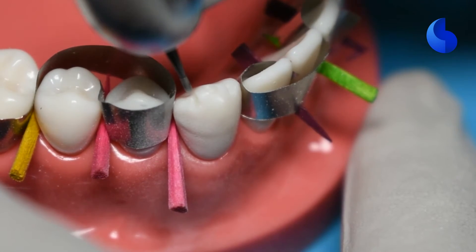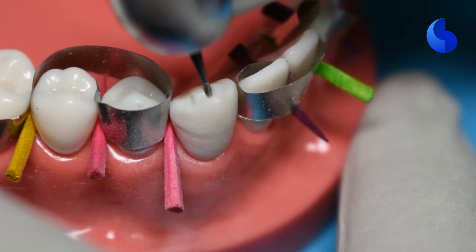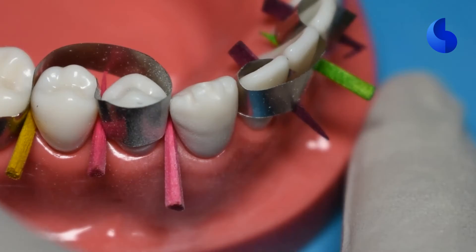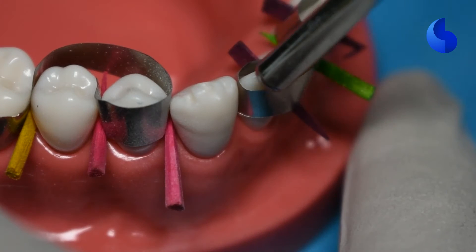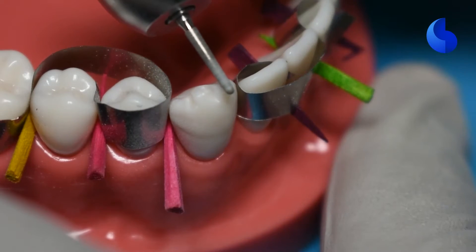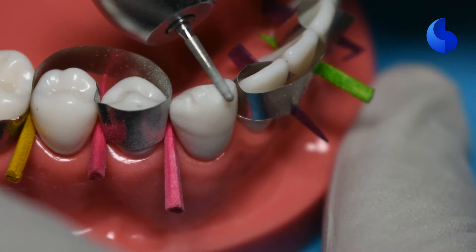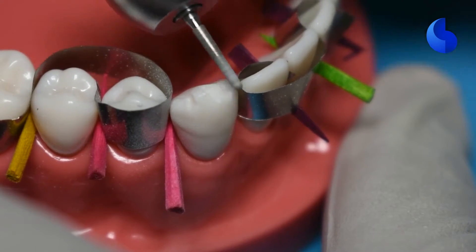You can also use a diamond bur to place these depth orientation grooves. Remember that these grooves should be oriented perpendicular to the long axis of the opposing tooth to provide adequate support for the porcelain material. Now you can go ahead and use a diamond bur such as an 856-016 to remove those islands of tooth structure.